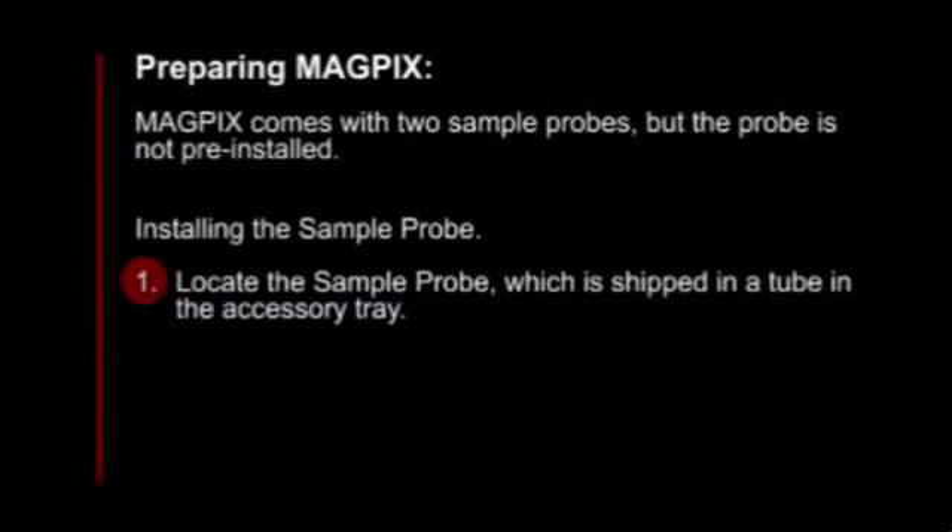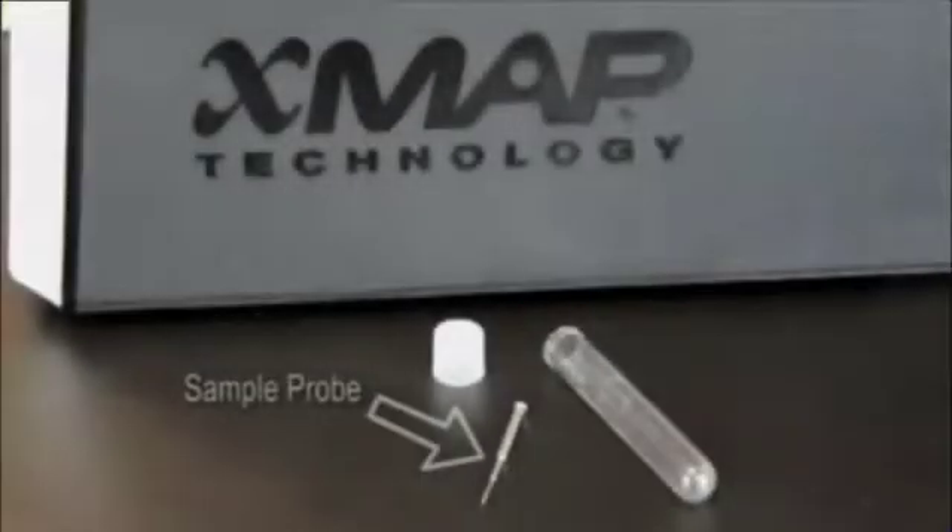MagPix comes with two sample probes, but the probe is not pre-installed. To install the sample probe, first, locate the sample probe, which is shipped in a tube in the accessory tray.